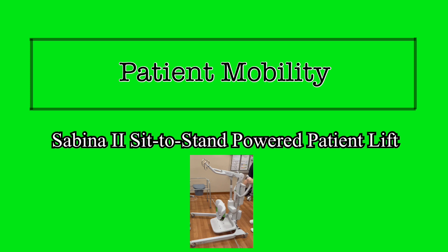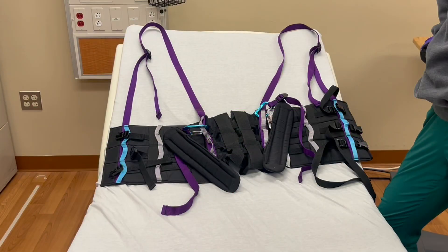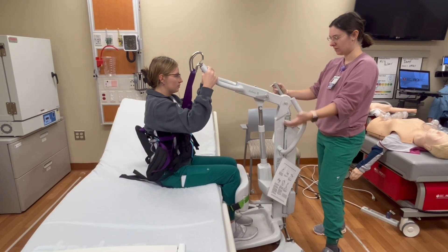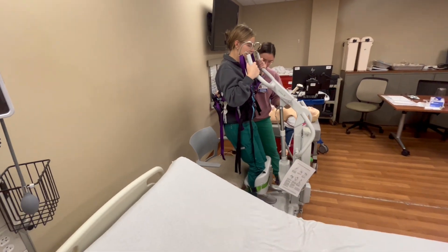This video will show an overview of the Sabina 2 and demonstrate safe use of the equipment to transfer a patient. The Sabina 2 is a sit-to-stand mechanical lift that uses a patient harness and a powered lift device to aid you in transferring a patient from a seated position on one surface, such as a bed, to a seated position on another surface, such as a chair or commode.